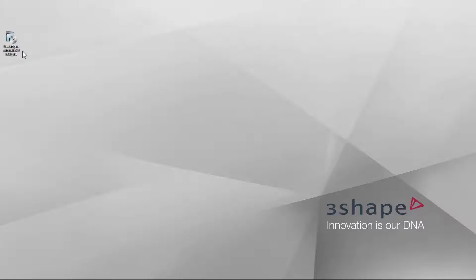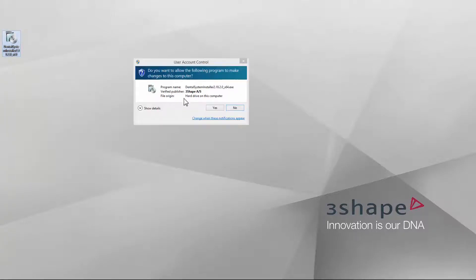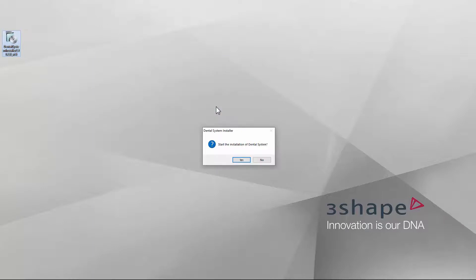When downloaded, run the installer as an administrator and click Yes on the dialog box.